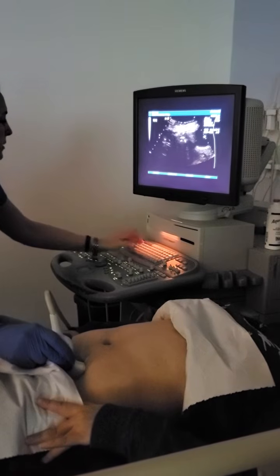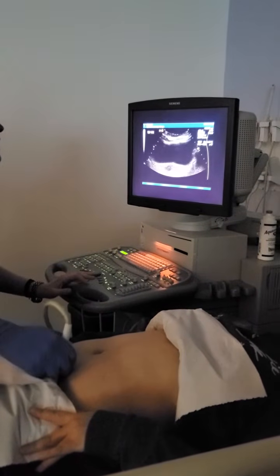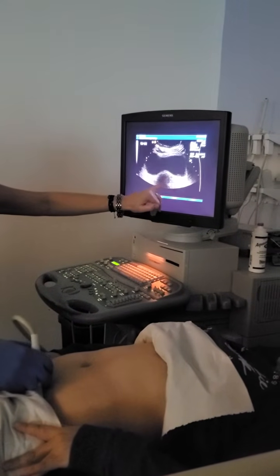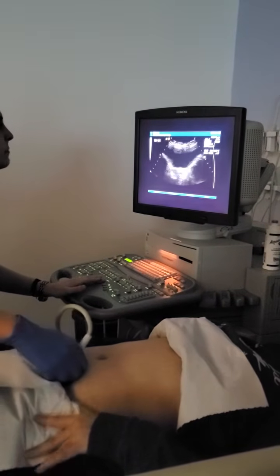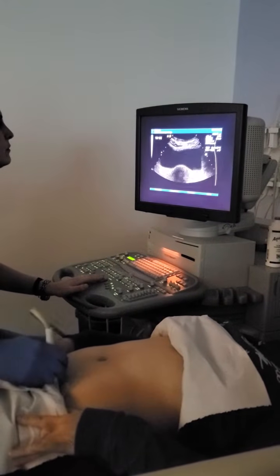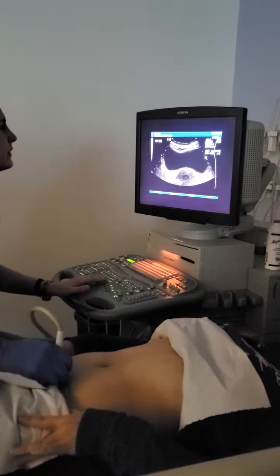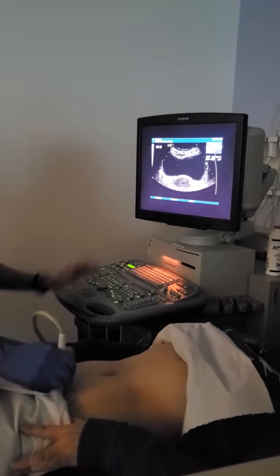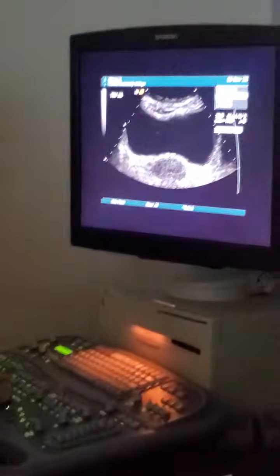Next up, we're going to go transverse. So switching to transverse. And so here we are in transverse. We've got vaginal canal coming into cervix, going into the uterus, and then here's our urinary bladder. So we're going to sweep through for pathology. No hairy scaries. So we're going to go where we kind of think this is generally the widest. So freeze our image there. So it's going to bring up my menu. It's ready for diameter 2. Let me save this real quick.